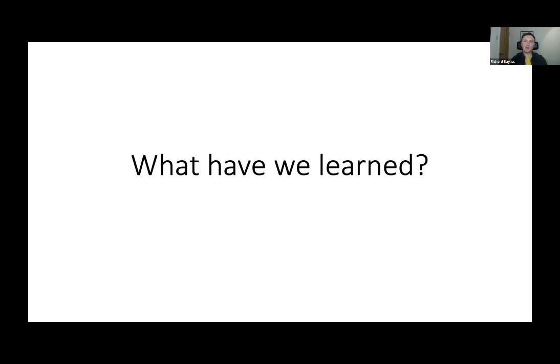I think that involves training both the operator, whoever that is within your service, and the airway assistant about how to use VL and how to get the most out of it. I think it's difficult in the current climate to justify, certainly in UK practice, either in hospital or in enhanced care teams, not having a form of VL available. And I think the evidence would support using it as much as possible to give yourself the best chance of successful intubation the first time, which gives our patients the best chance of recovery, which is ultimately what we're all here for.